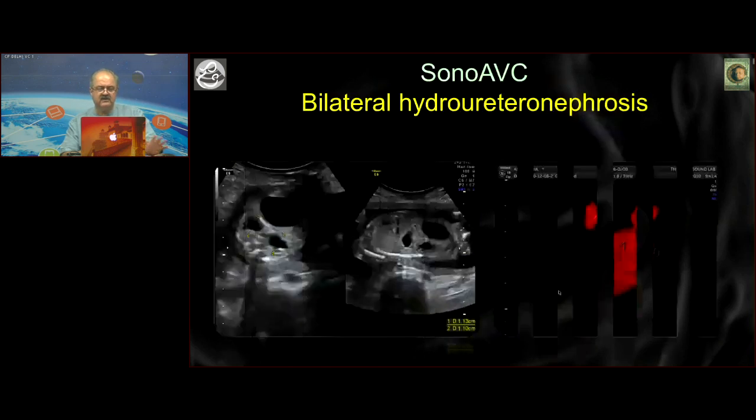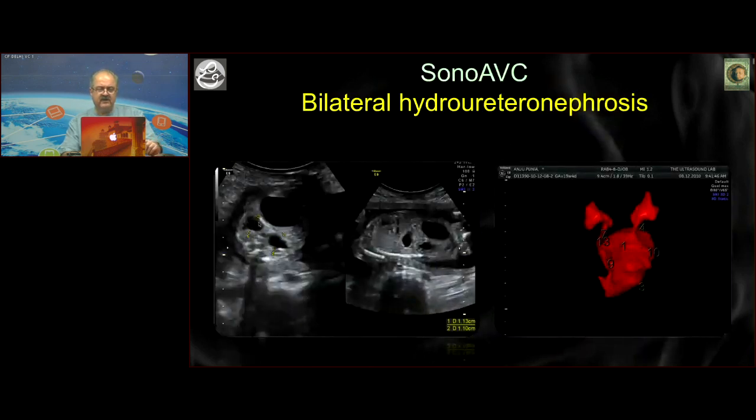You just take a clean sweep. Again, you suspect that of course these must be bad kidneys. There's a shaggy cortex which is thinned out and two spaces here at the back of the fetus, and there's a bladder almost coming up, and then you try and do it and you say, yes, of course. There's an inversion and then a color assignment that is a part of the software. You have to just press a single button and you realize that there are very, very short ureters, that there's bilateral hydroureteronephrosis and a hugely enlarged urinary bladder, about 10 times as large as each of the kidneys.